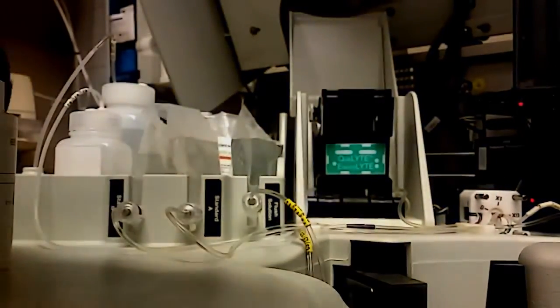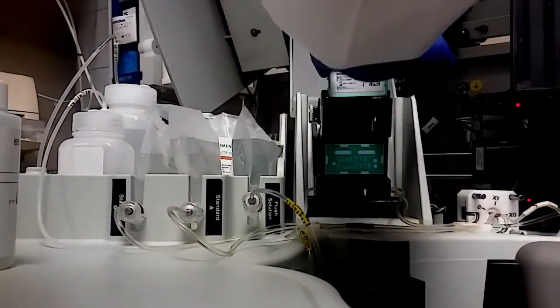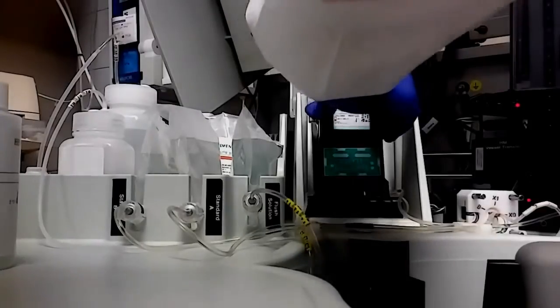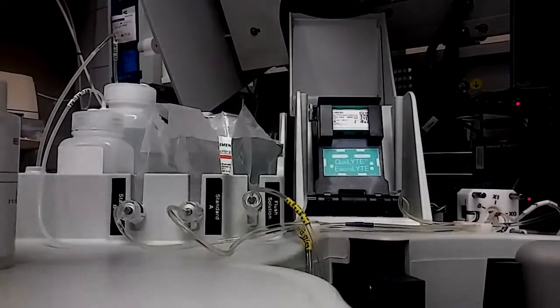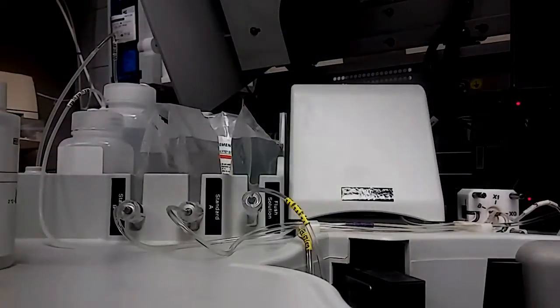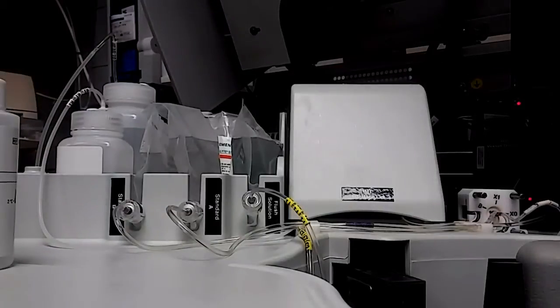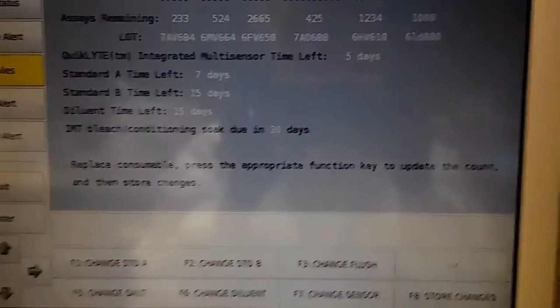Just try to touch the sides. I'm going to have it facing in this direction, place it in here, and push until it snaps. Don't forget to put the lid back down, otherwise your top lid up here won't close. Now I will store the changes — don't forget to do that, otherwise it won't save that you changed the sensor.